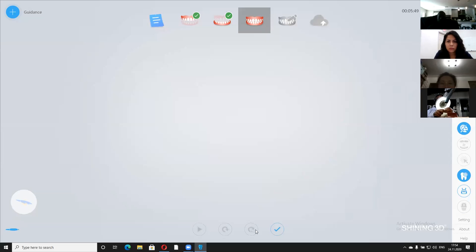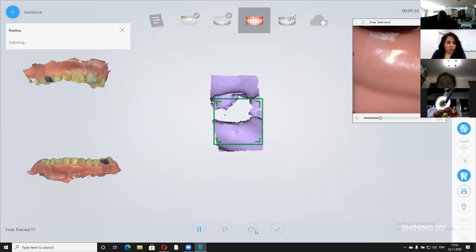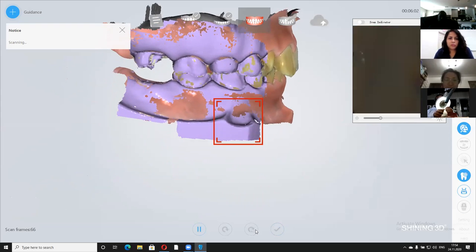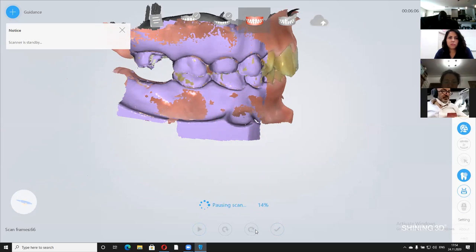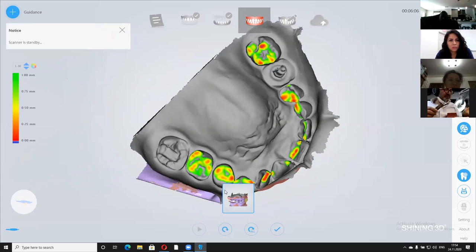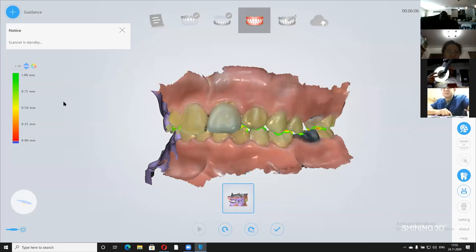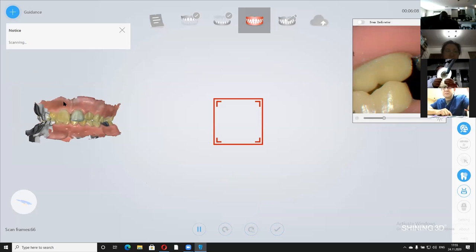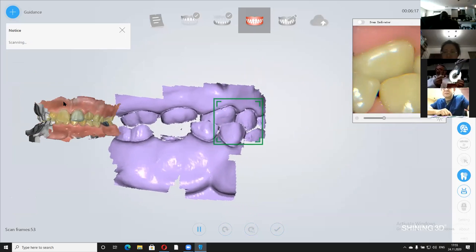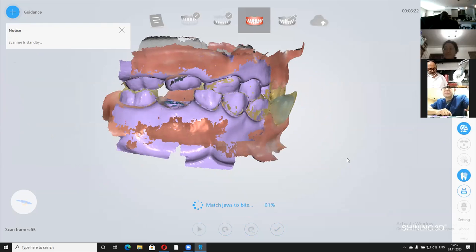So what I do is I pick up the scanner, I start with one side. I go, for example, to the molar back here, and I go up and down, and move forwards. And it'll instantly find the occlusion. So it's found the occlusion. I put my camera down again. It's got one side done. We can check if it's good. Yeah, it looks okay from the occlusion, but to verify, I will also do the other side. So I go to the other side here and I take the camera up again, and it's intelligent enough that it knows that I'm doing the other side. Boom. It's happened, the scan is done, and you will see the whole process is basically finished.